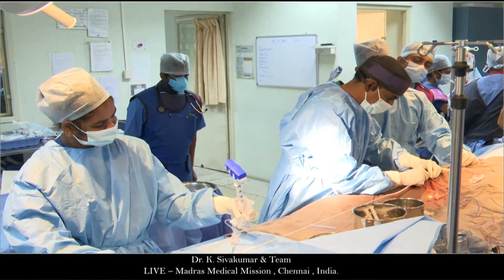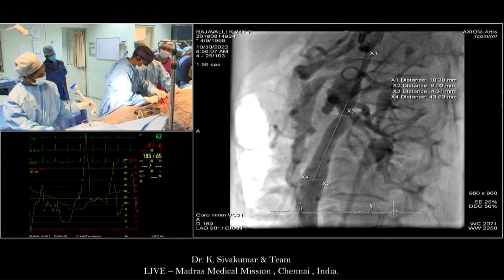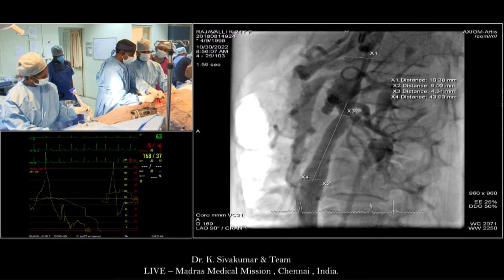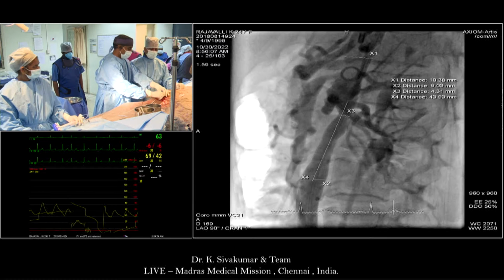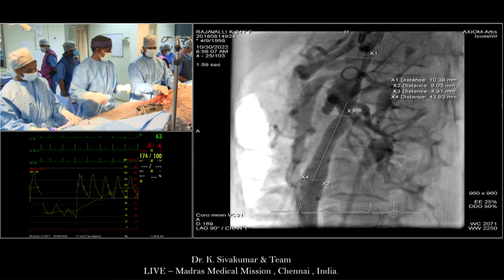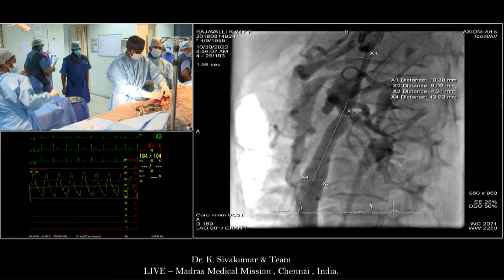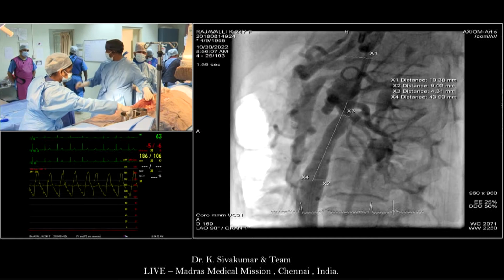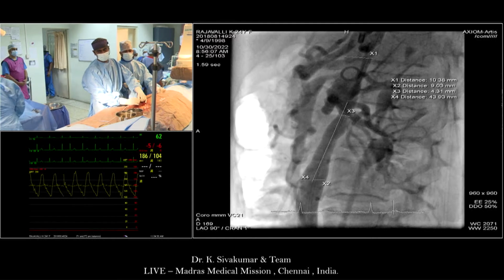Let me see whether I can. It's pretty tight. Oh, okay. No, it's not. So I thought of going gentle on the groin with a 12 French sheath, but now I probably may have to upsize it. I told you to use a larger sheath, remember? Zahid, the problem is it's being an artery, 14 French sheath. Or else give me a 13. Let me go a little. Cook 13 sheath. Being an artery, I was trying to be a little gentle on the artery, Zahid.